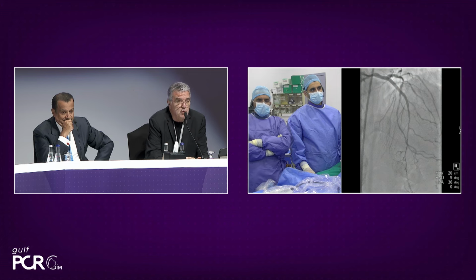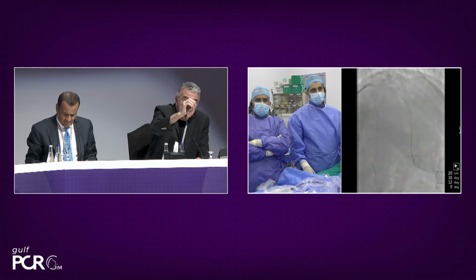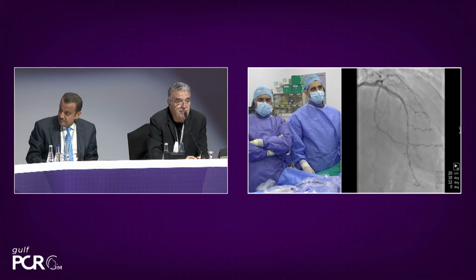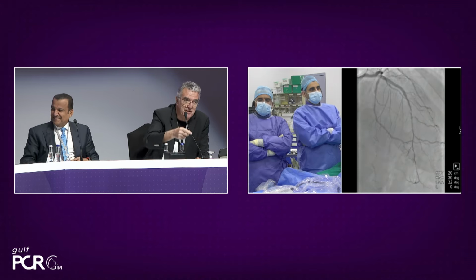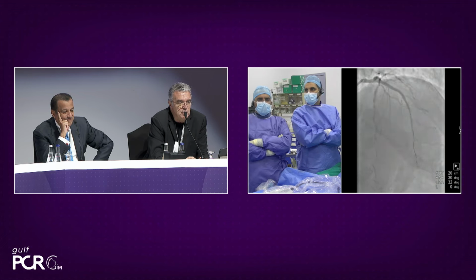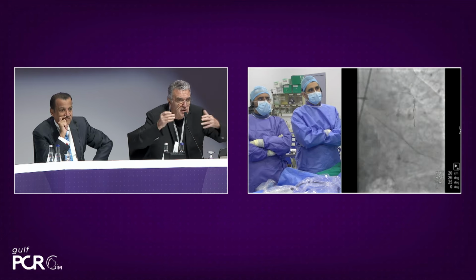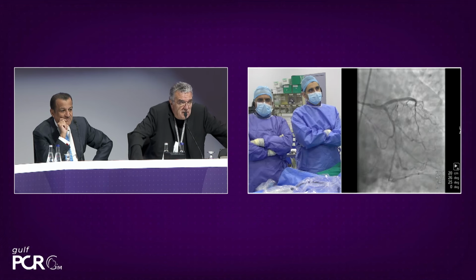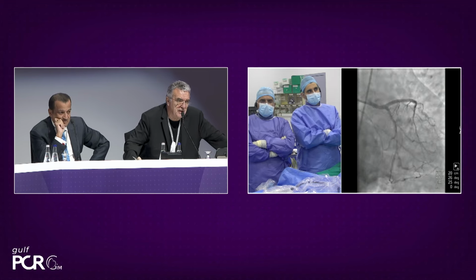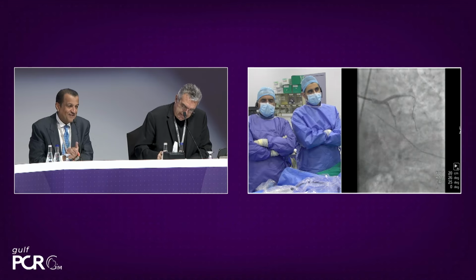So what we could do in this particular case is to treat by stenting the proximal LAD zone, and then accept the result and make it acceptable, and avoid implanting a long additional stent, because this would not be the right thing to do for the patient. So I think the result is good. You have a good flow. You could work with low pressure balloon inflation. This works sometimes in this kind of situation. But at the end, I would like to thank the operator, because the result is more than acceptable. Thank you very much, Khalid and Abdallah. Thank you for a great job done.